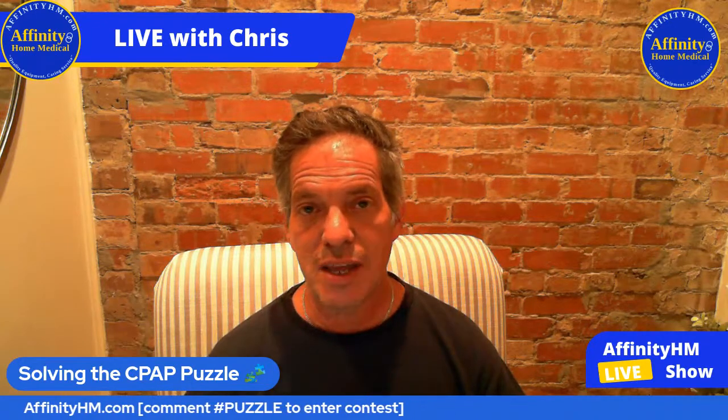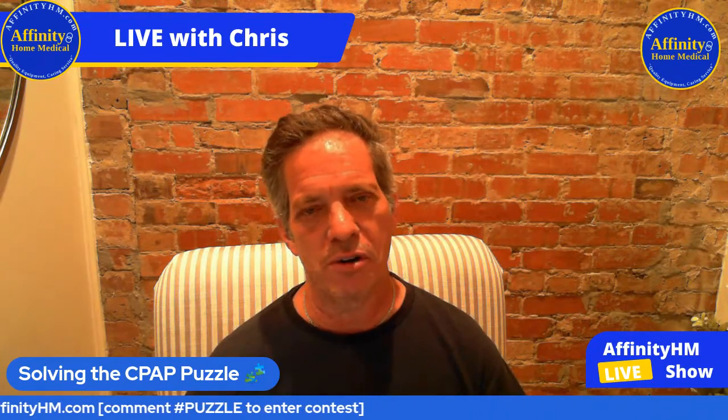But the sound of the leak is number one. Then check your data is number two. On your screen of your CPAP machine, there's going to be a place where it's going to show you the next morning how much of a leak that you had. Okay, in the data, you're going to want that leak to be, the book says 24, in the respiratory books. All right, but I like 20. I like 20 or less. 20 liters per minute or less is an acceptable leak. So nothing you need to do if your leak is that low. But that's the answer to that.